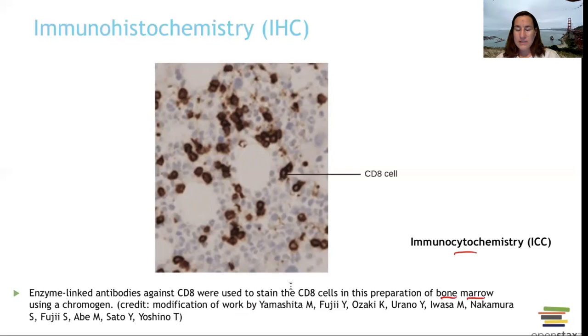So these are immunohistochemistry and immunocytochemistry. Histo, staining it and being able to see the individual cells within the tissue. And cyto is when you mess with the cells and their cell membrane, and you can mess with the permeability, basically, of those guys. Let's move on.